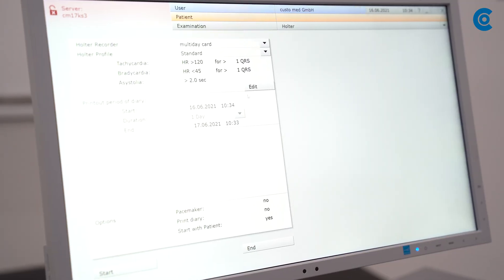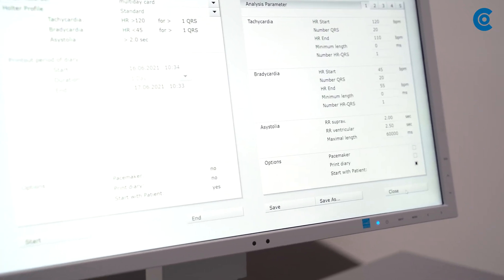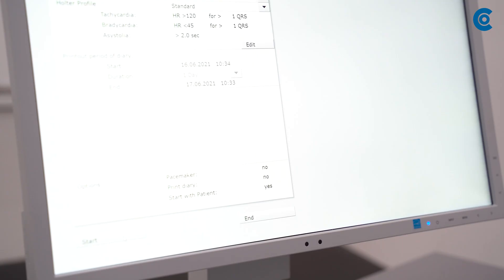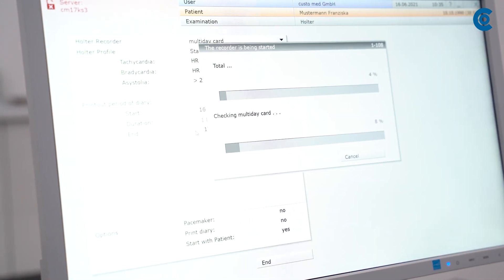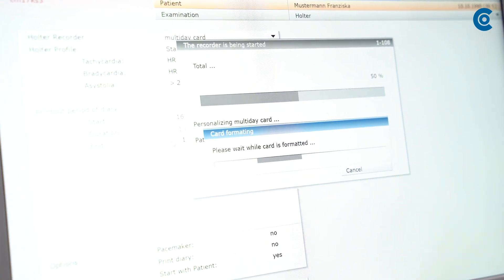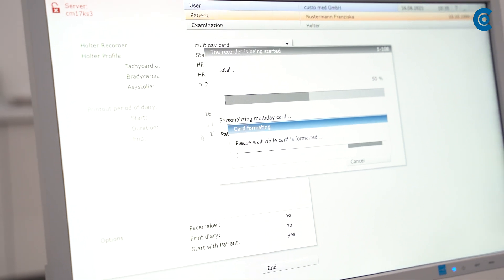Under Edit, you can change the preset recording parameters or the pacemaker detection. You can also print the patient diary. Now click on Start and create the patient data or use already existing data. Transfer them to the Multi-Day card by confirming the selection.